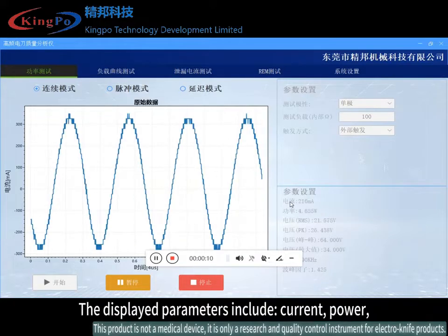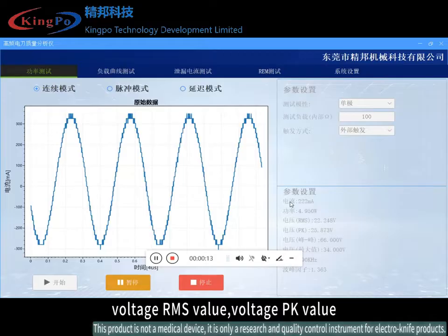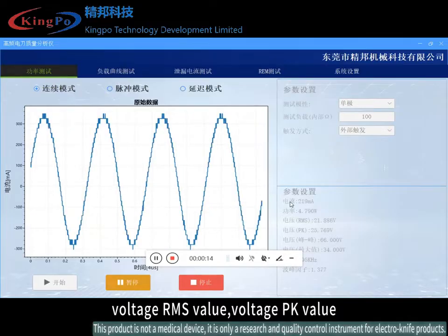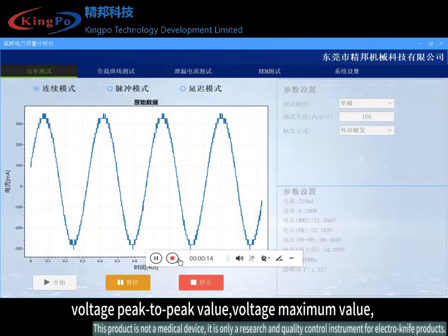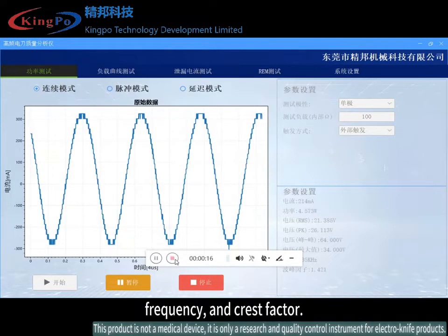The displayed parameters include current power, voltage RMS value, voltage PK value, voltage peak-to-peak value, voltage maximum value, frequency, and crest factor.